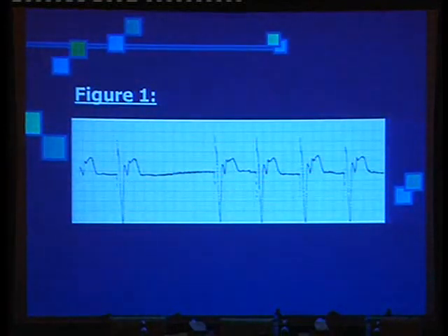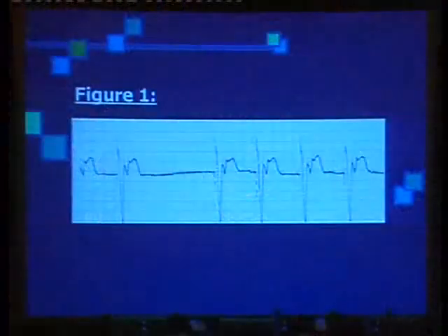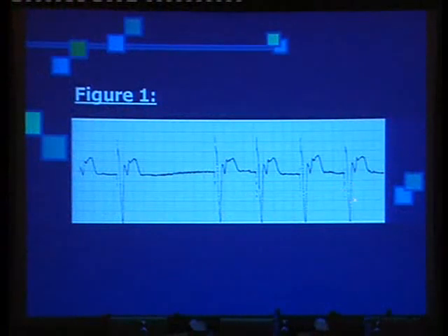This is the figure, actually. If you look at the figure carefully, you see the spike here. This is a spike, and after that you can see the depolarization and contraction of the ventricle. But we do have a pause here. The cycle lengths between here and here and here are equal, about 70 beats per minute or 850 milliseconds. But we do have a pause, and after that we do have another beat. But the spike is everywhere here, so the spike is not wandering.